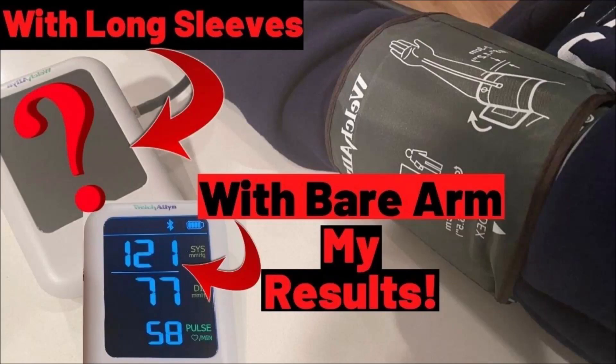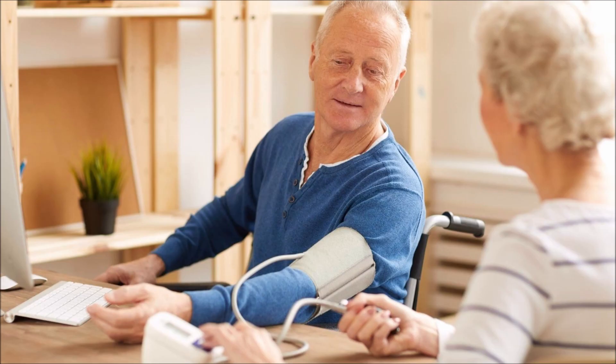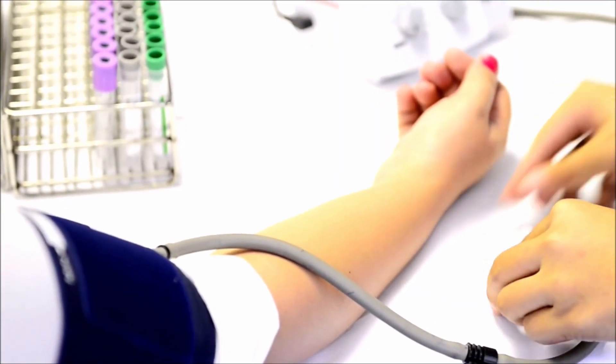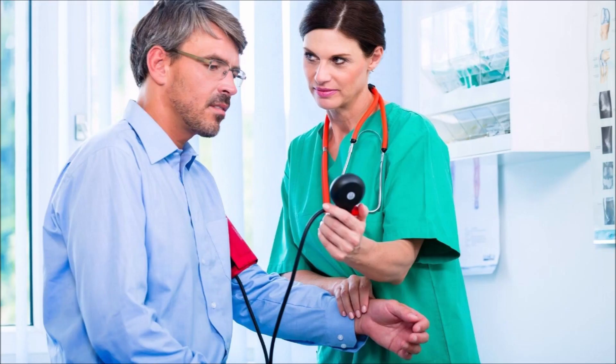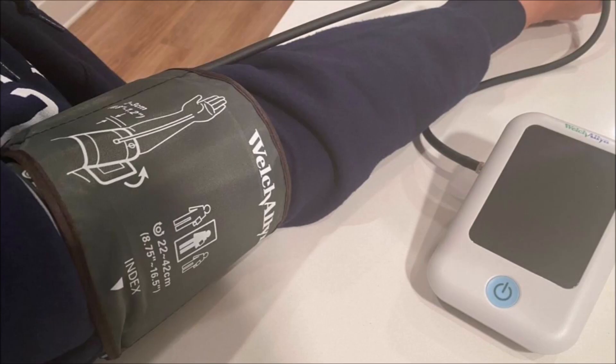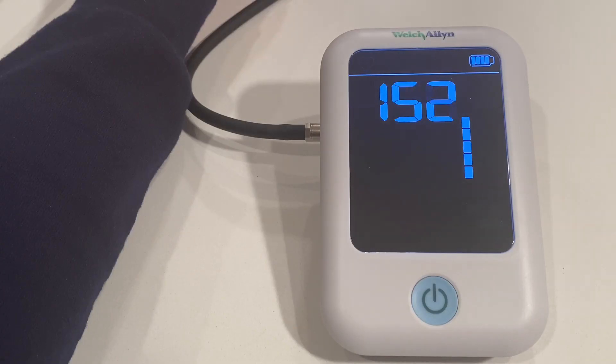In this video, I'm going to talk about blood pressure with long sleeves. You've heard of this — I even had a nurse take my blood pressure over my sleeve once. So does it really make a difference? I'll let you know and test it out on myself in this video and show you the results.